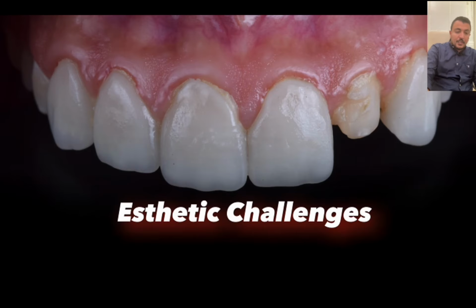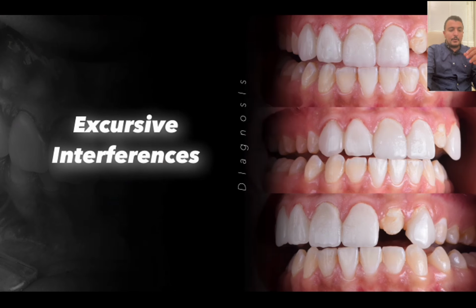So sometimes we have a lot of aesthetic challenges, not only the shape, the contour of the teeth, the gingival inflammation, but sometimes we have a lot of problems regarding the excursive interferences. For example, for this case, this is a protrusive movement, we have canine interferences. This canine will affect the occlusal relationship and also will affect the quality of the TMJ. And this patient came to my office seeking treatment for these restorations and also complaining of a severe pain in the TMJs.